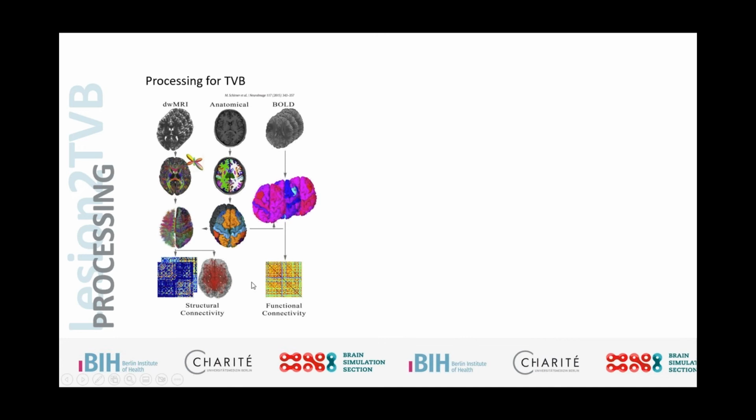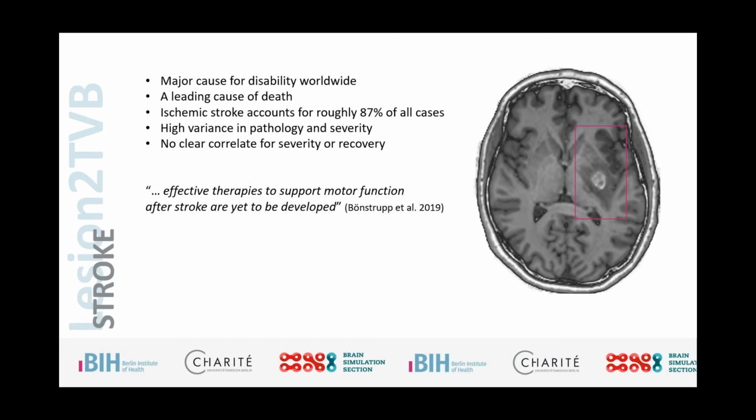to combine with the parcellation and get our functional connectome at the end, so that we can have our individual subject model based on the structural properties that we extracted, based on the diffusion weighted imaging, right? The tracks that we counted for the regions that we extracted, and then run a simulation and really validate it against the functional connectivity that we have available, because we want to map our model to really fit the data and create the functional connectivity and represent the same kind of activity, so we can use our TVB model to try to dig deeper and use it as our mathematical magnifying glass, right? Which is the goal with TVB.